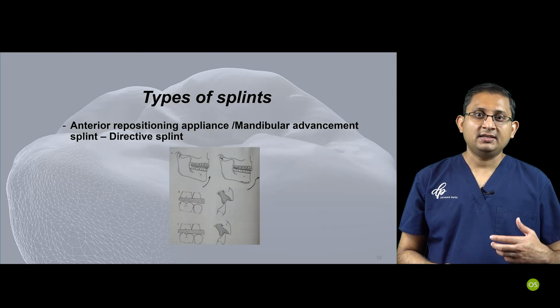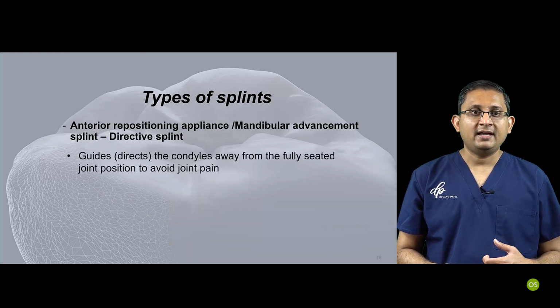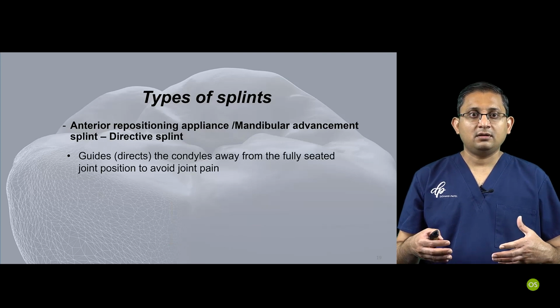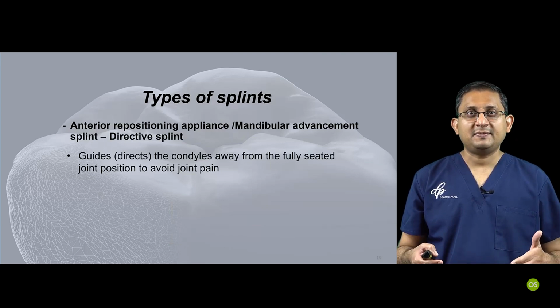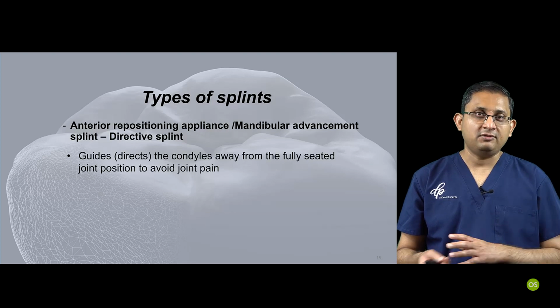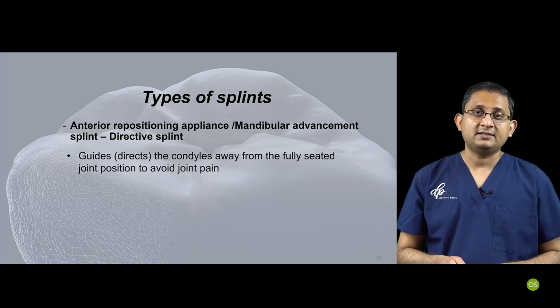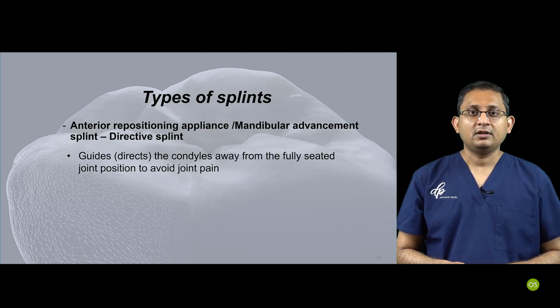This is used in specific conditions, when you have disc displacement with reduction, and we'll go through how to use this splint in detail later on.